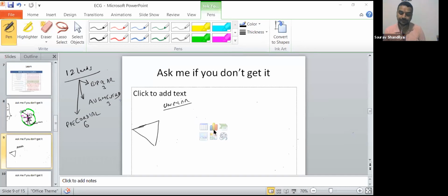If you see from lead 3, I told you we see anything from the positive side. Left foot has been given positive. So we have two views of inferior. So we are going to see the heart from the inferior. That is the reason. Lead 3, I did not detail you. Anyway, now come to this, and then we'll talk other things later.